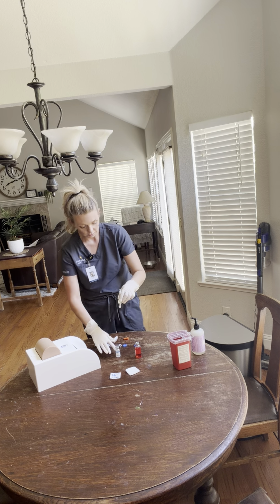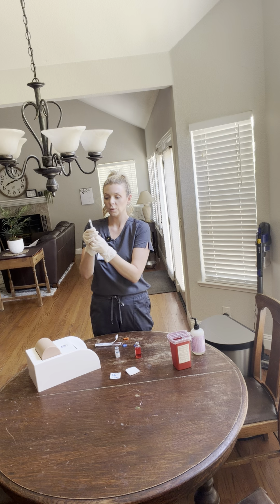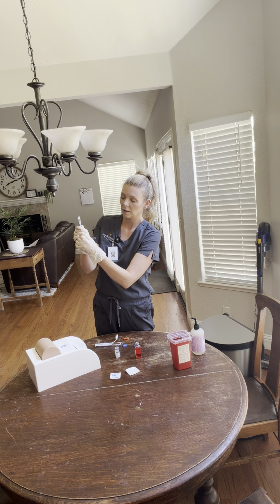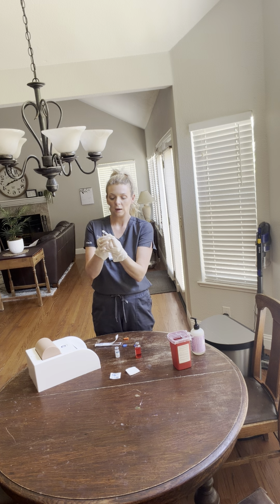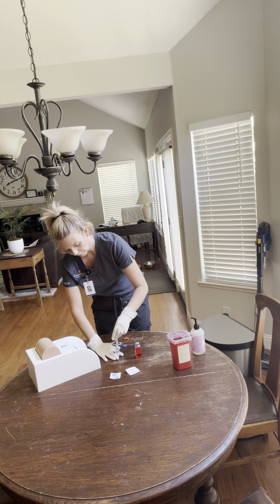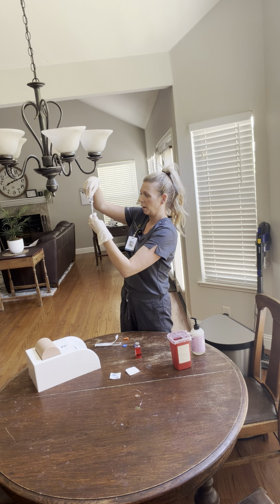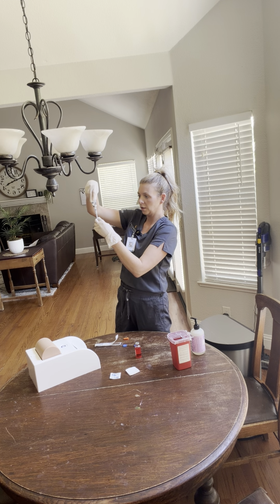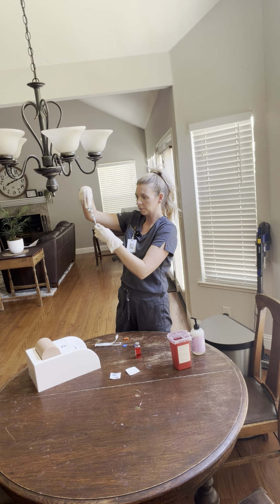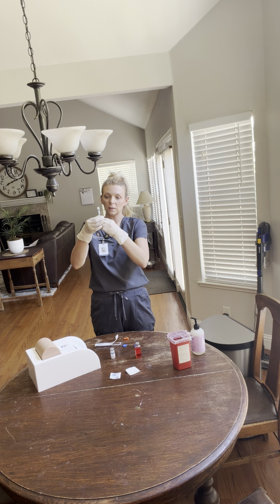and without touching anything, I'm going to draw up exactly 4 units of air, and I'm going to do the same thing, inject that directly in to my vial of regular insulin. I'm going to invert, and I'm going to draw up 4 units of regular insulin, making sure there is no bubbles. And I have no bubbles.